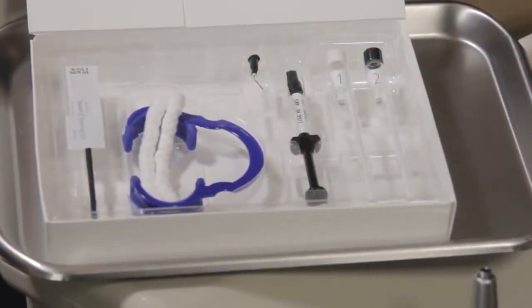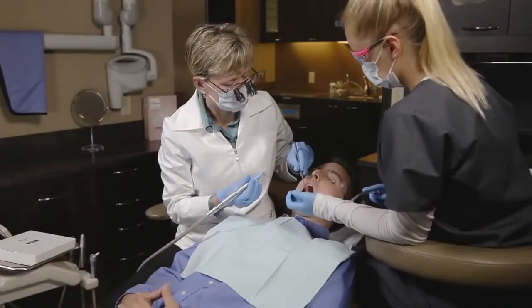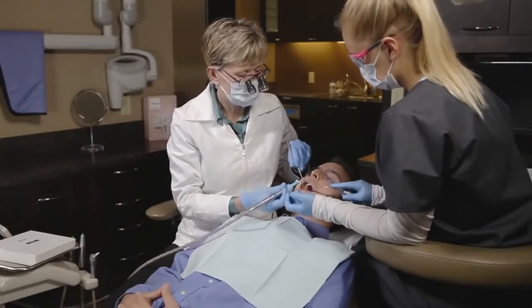Everything you need for a Quick Pro treatment is in the kit. To start the treatment, make sure the patient's teeth are free from moderate to heavy plaque and calculus buildup. Ideally, Quick Pro should be applied immediately after polishing with a standard Prophy Paste.